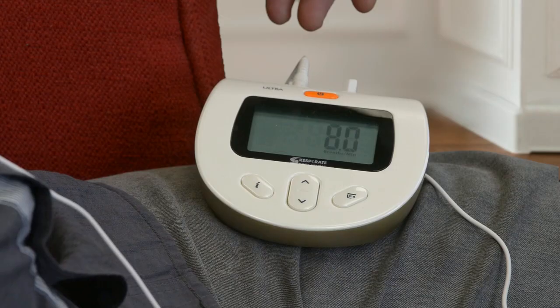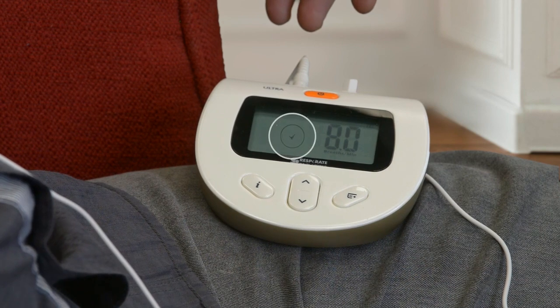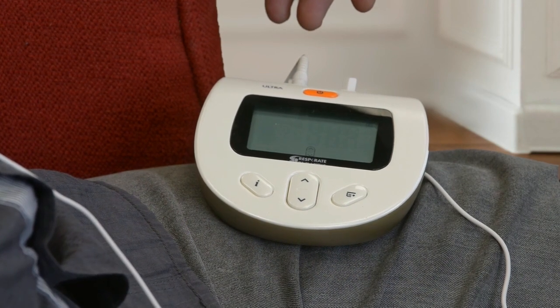In a full session, RESPeRATE will continue to guide your breathing into the therapeutic zone of less than 10 breaths per minute. When your breathing is within the therapeutic zone, a circle will appear. Each minute spent in the therapeutic zone will fill a segment of the circle. Your goal is to accumulate at least 10 therapeutic minutes and fill the circle. Breathe without effort. If the guiding tones are uncomfortable, hold down the Info button and RESPeRATE will refresh. You have successfully completed the RESPeRATE tutorial.